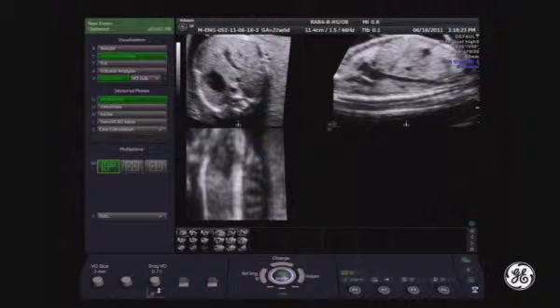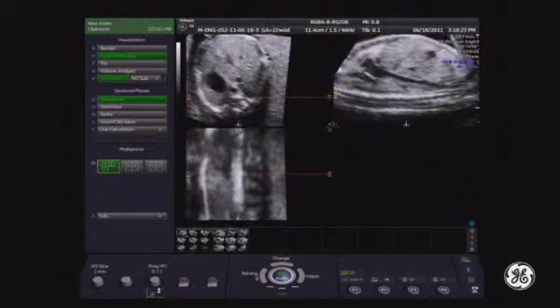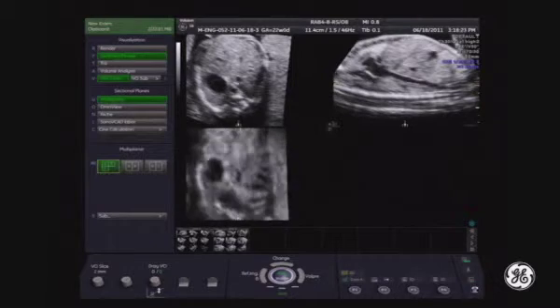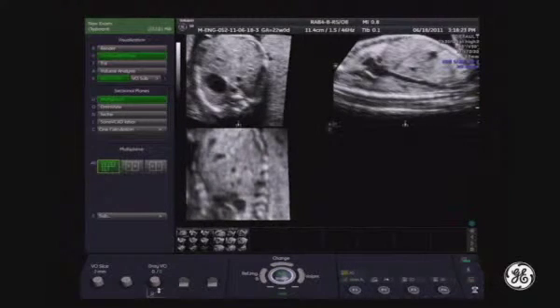I will make it fully horizontal, like this. So now let's bring the pivot point in B to the level of the upper abdomen, because you can see that this is the middle of the fetal trunk.